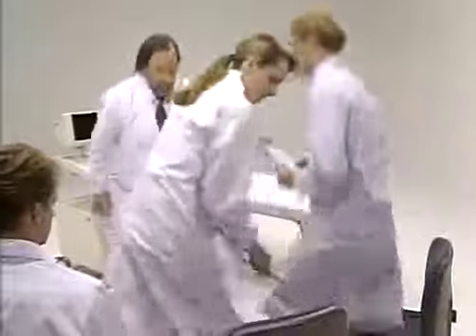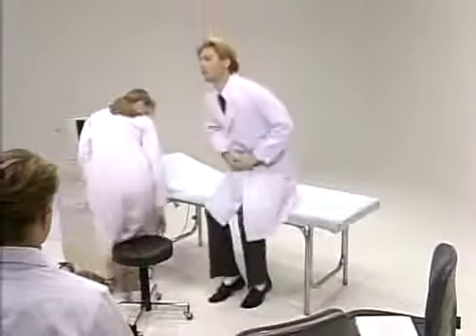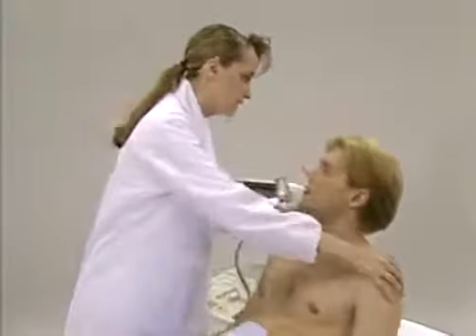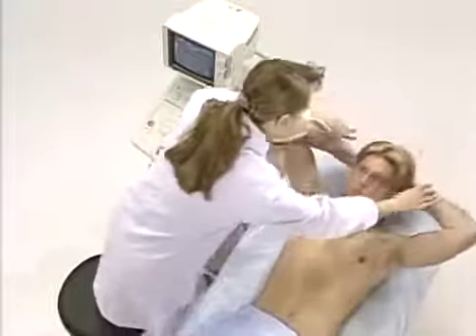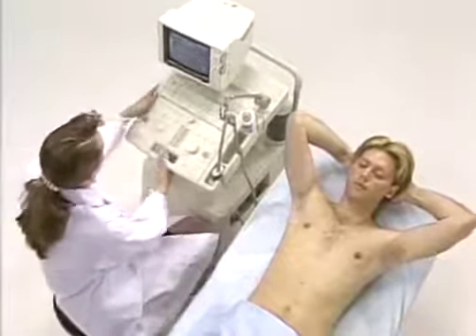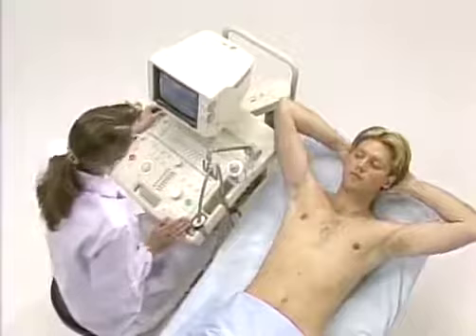Right, let's start the examination. Christine, you'll examine Paul. Paul, you'll be the patient. First of all, have the patient lie supine on your right. Tell the patient to clasp his hands behind his head to widen the intercostal space. Then, arrange the operating panel so that you can examine the patient with minimum effort.